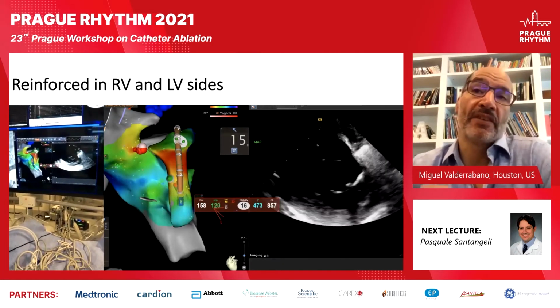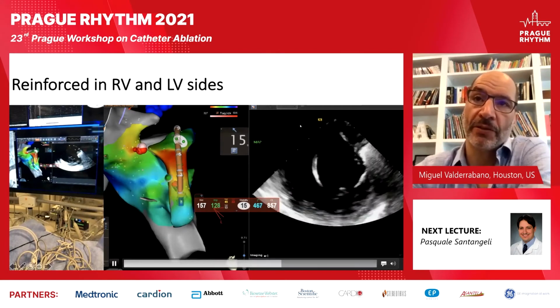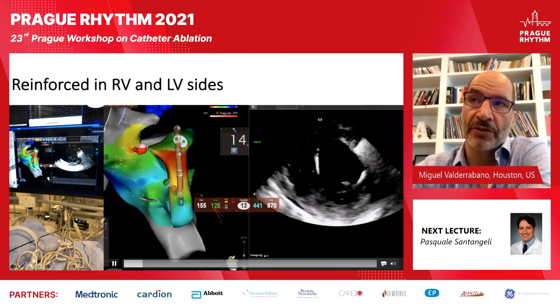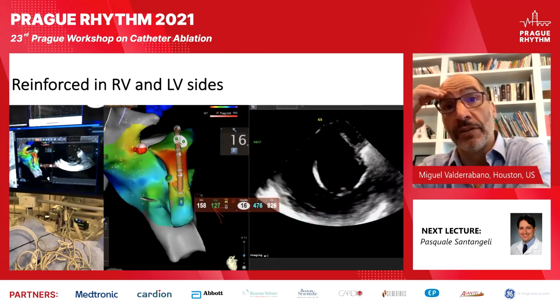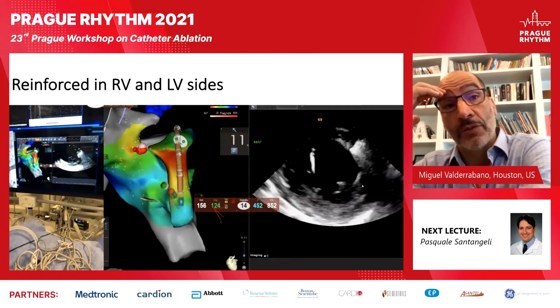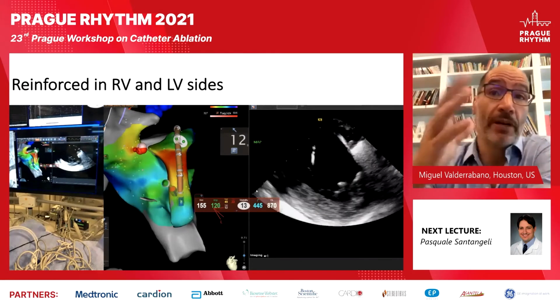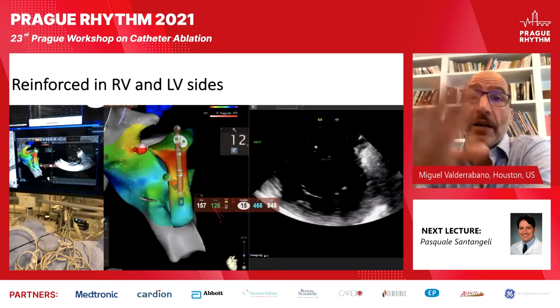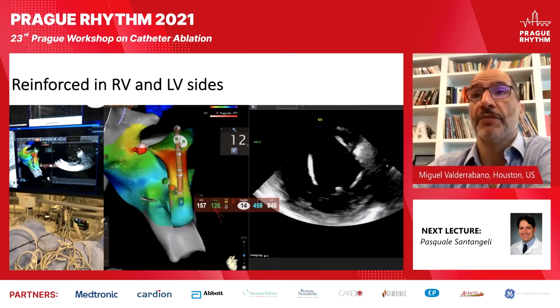The idea is, for someone that has had 3 ablations, you want this procedure to succeed and be the last one. So as much as I believe in alcohol doing the job, and I like to target a signal that is 45 milliseconds before the QRS as opposed to a mediocre signal in the neighborhood, I like to reinforce it too. There's no point in being dogmatic here. The idea is to get success for the patient.